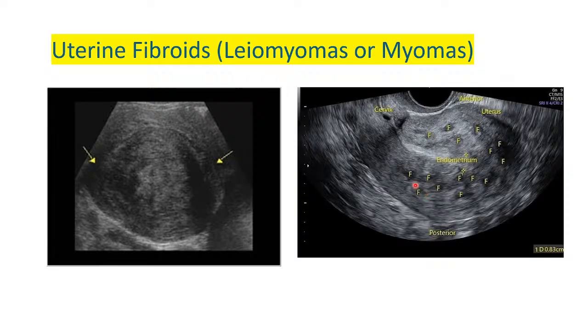But they are not fibroids in this case because this patient has a history of a cesarean section and the endometrium is indistinct there, sort of disappearing. Here you cannot differentiate the myometrium from the endometrium. So this is diffuse adenomyosis. We are going to discuss adenomyosis in due course when we will be dealing with endometriosis.